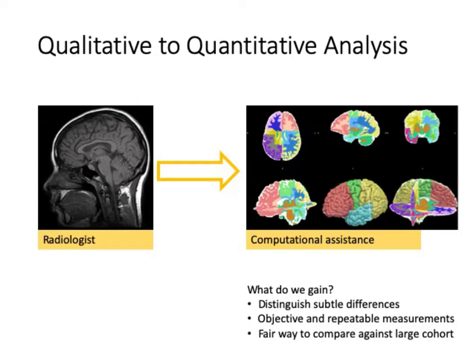Conventionally, radiologists and sometimes neurologists perform visual assessment on MRI images such as this by inspecting axial, coronal, or sagittal slices. The accuracy of assessments, which is good enough for diagnosis and something that is not easily replicated by computers, depends largely on their background, their training, their expertise, and their experience.